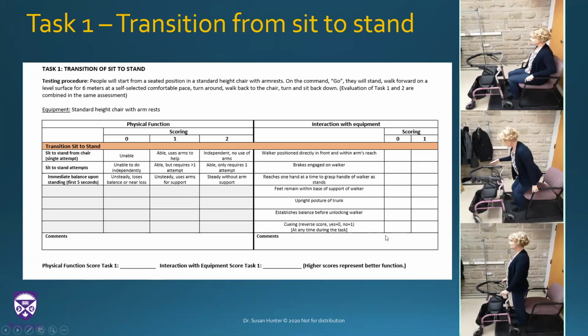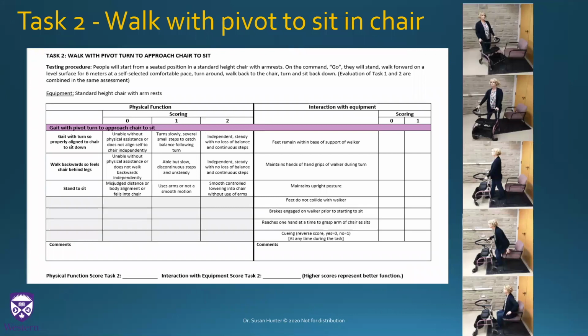And again, this is just a demonstration of sit to stand and what it should look like. Once they get standing, we then have them walk forward, and we look at what happens when they come back to sit in the chair again.